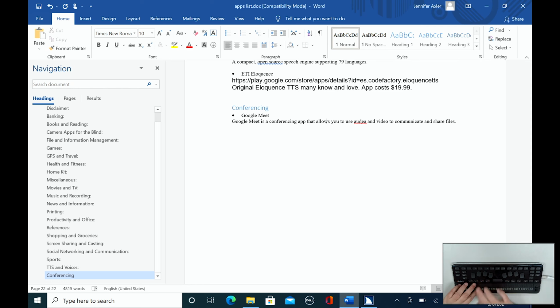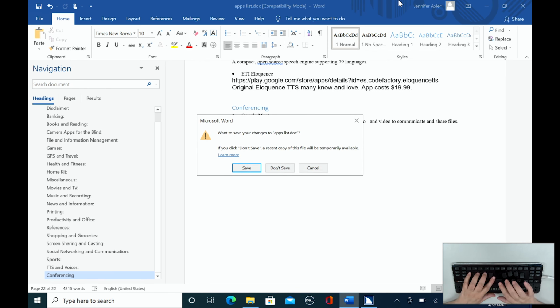It even underlines it for me on the braille display. Fabulous. So I have audio. I don't know what I was thinking there, but we'll just try to fix that. Misspelled, E-I-O. So there we go, we fixed it. And I'm going to go ahead and save this, so I'll press Alt F4. Microsoft Word. Save button. And again, I can just press Enter.